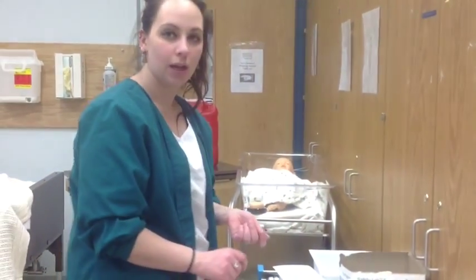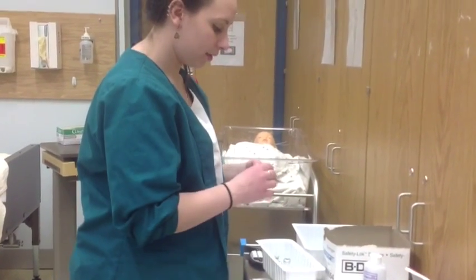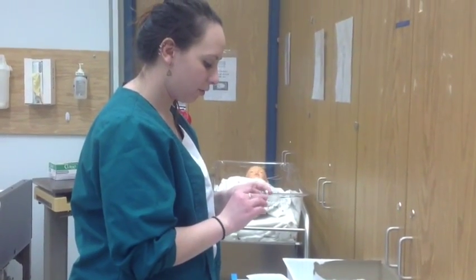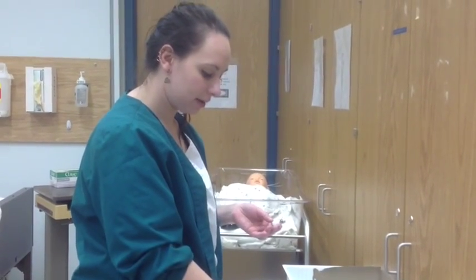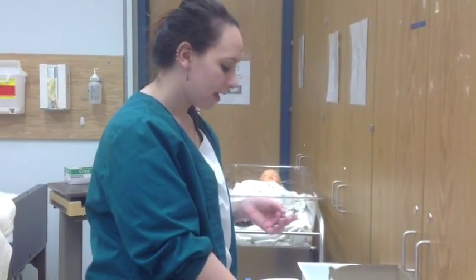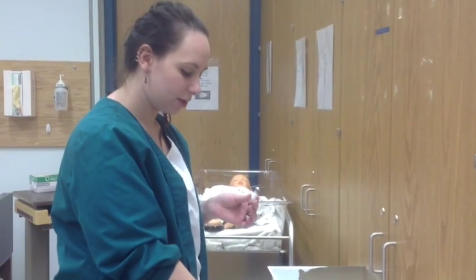So I'm going to unlock my med cart. I'm going to open it up. I'm going to find the medication that I'm looking for. So this says Hep B. So I'm going to look again. So hepatitis B vaccine. This is an IM solution. So I have the right route for the medication.